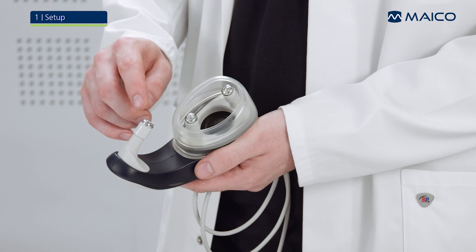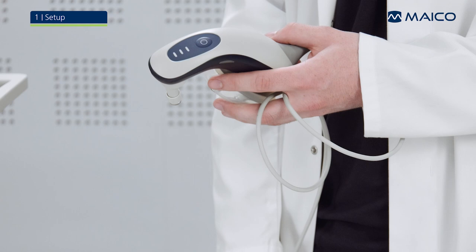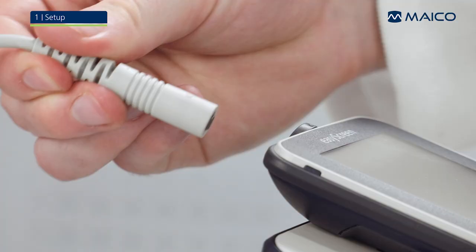This video will show you how to perform an ABR screening using the MAICO easyScreen and the new BERAphone. The BERAphone is equipped with three measurement electrodes, the ear cushion, two left and right indication LEDs, three status LEDs, and the user control button. To connect the BERAphone to the EasyScreen, search for the dots on the connector and push the plug straight into the socket.